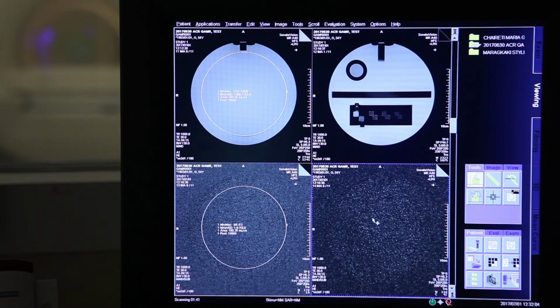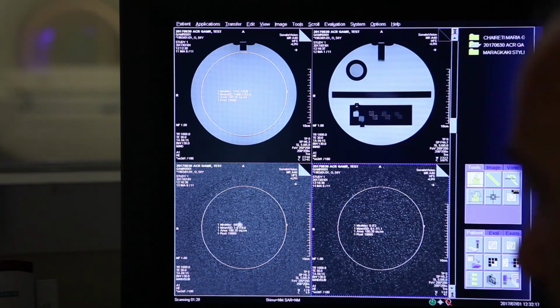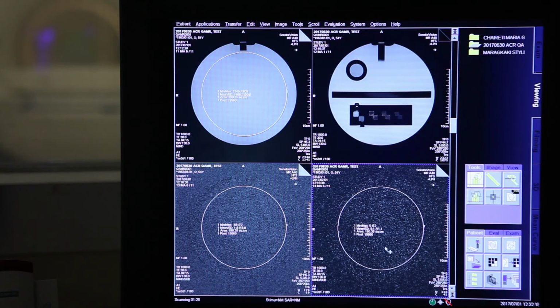Do it again here, paste again. Same ROI, shift it to the background, to the subtracted image. What you take in here, you see you have the mean and standard deviation, 1.8. Compared to 8.1. Reverse. Can you imagine the difference?